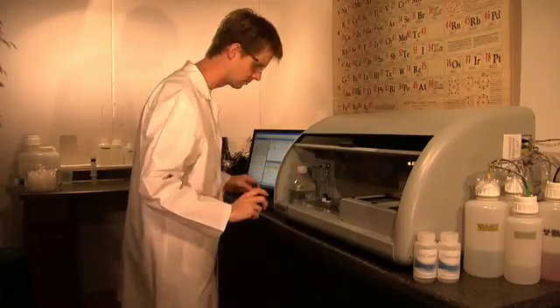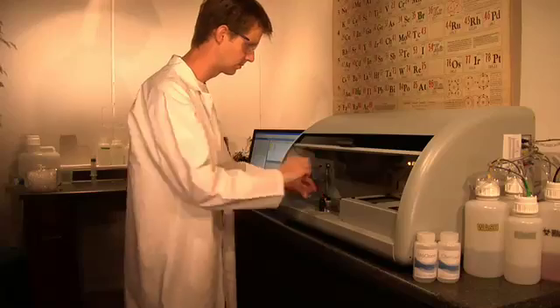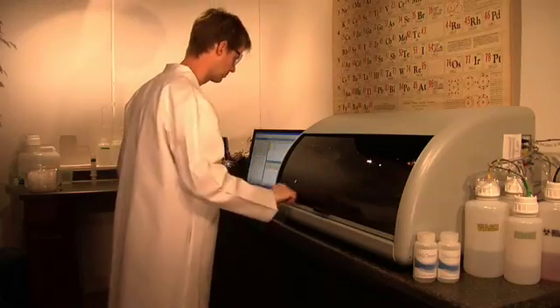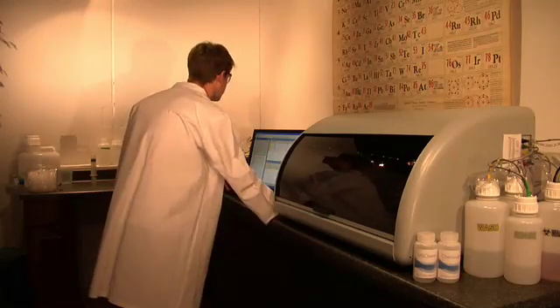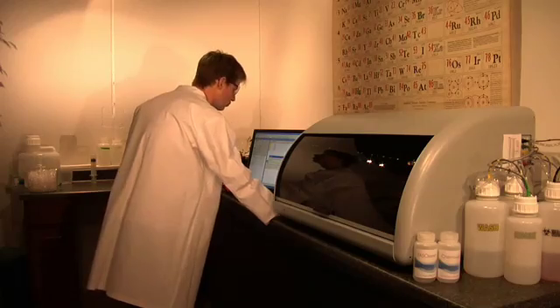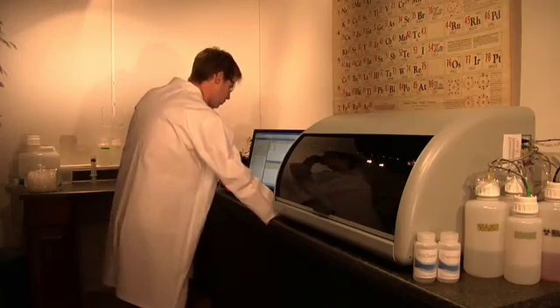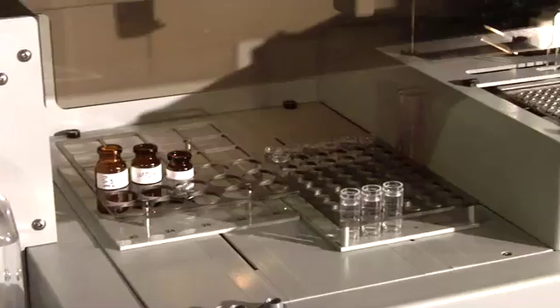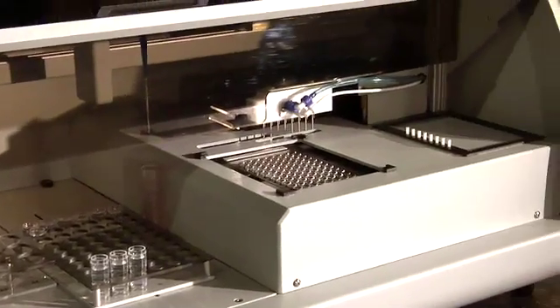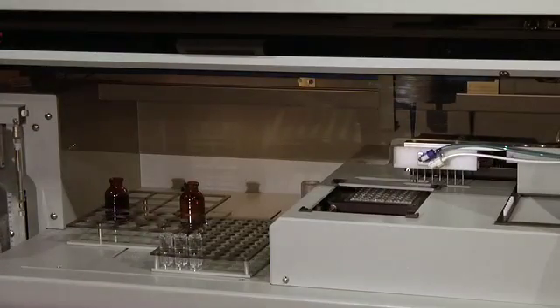To perform a test, a lab technician loads the reagent and sample racks. Then the technician enters the location and contents of the reagents and samples into the RAPID software and defines the desired testing parameters. The Astoria discrete then tirelessly works away, automatically analyzing up to 200 tests per hour.